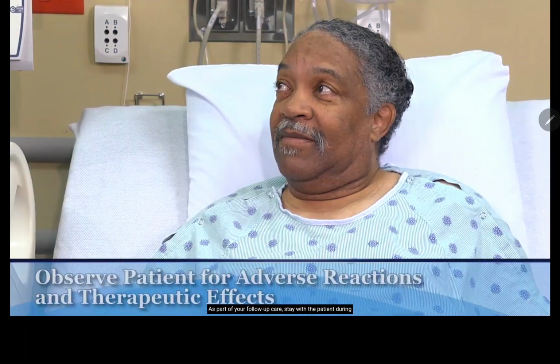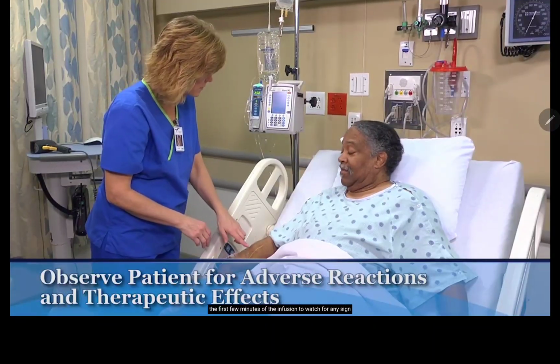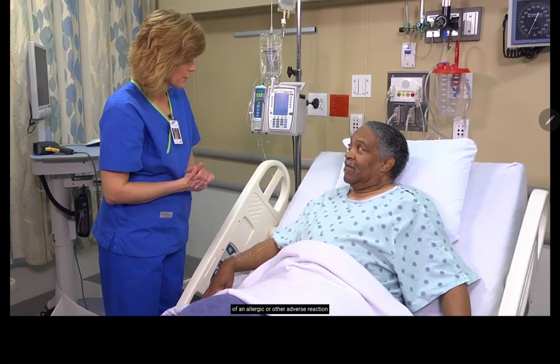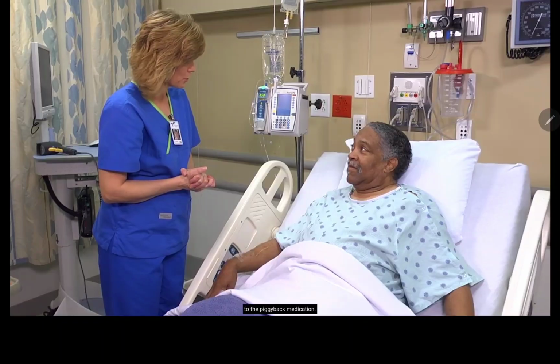As part of your follow-up care, stay with the patient during the first few minutes of the infusion to watch for any sign of an allergic or other adverse reaction to the piggyback medication.